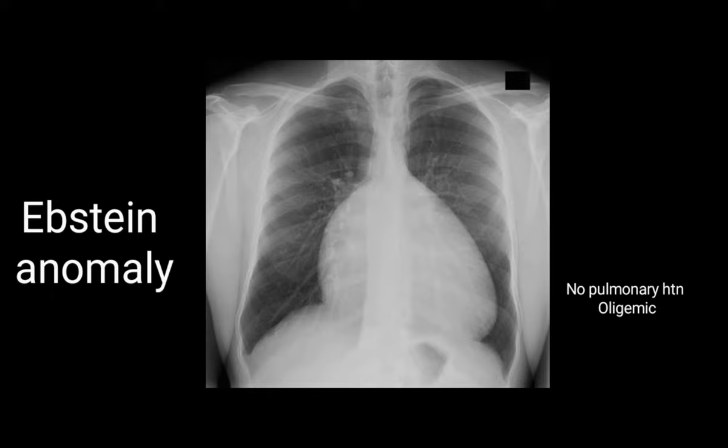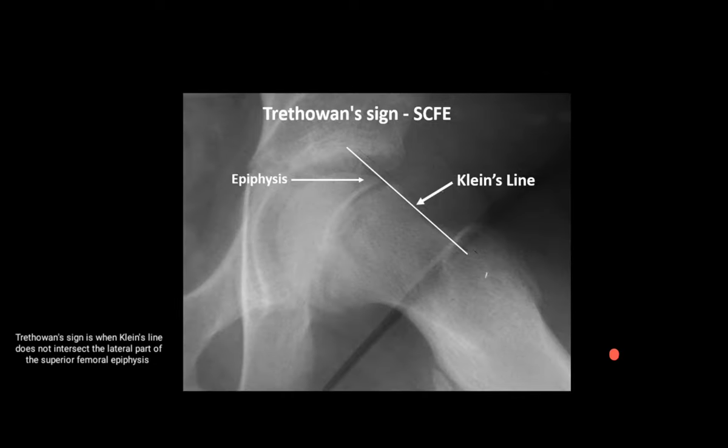The next image is of Ebstein anomaly. Ebstein anomaly shows a box-shaped heart, and we need to remember that there is no pulmonary hypertension and the lung fields are oligemic. This is the X-ray image of Ebstein anomaly showing the box-shaped heart.